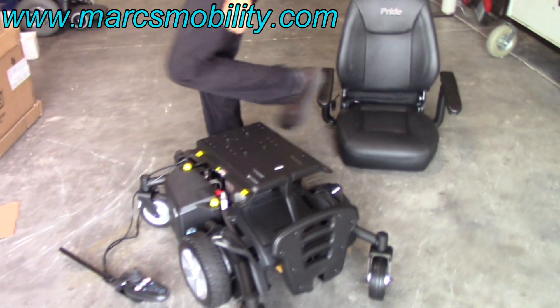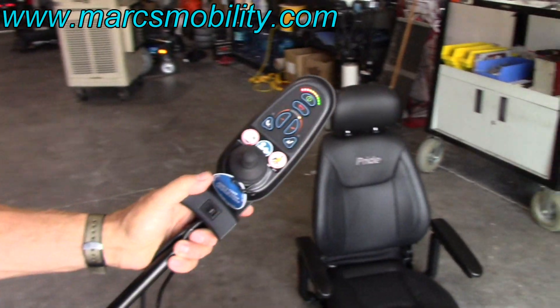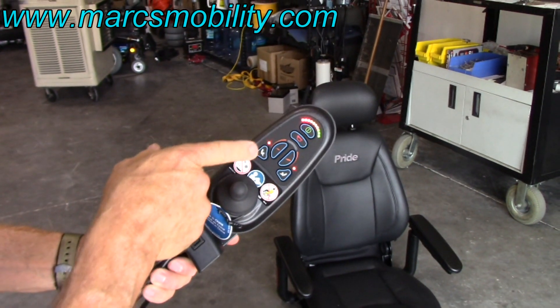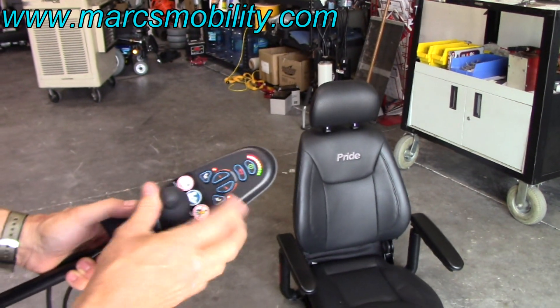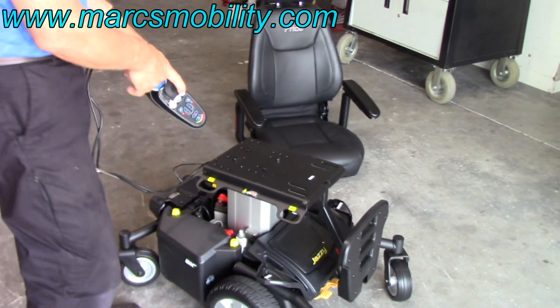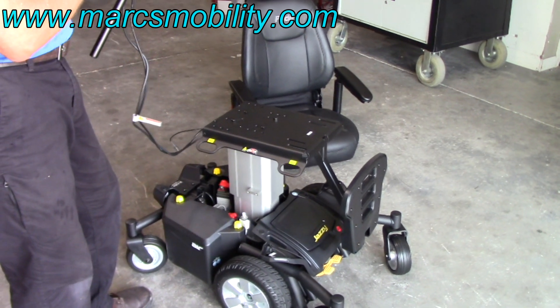Take your joystick, turn the power on on top, hit this button for the seat lift. When that light comes on, the seat lift is on. Move the joystick backward and you'll see your seat is going up. It's easier to put the seat on when the seat is elevated, so you're going to elevate the seat until it stops.